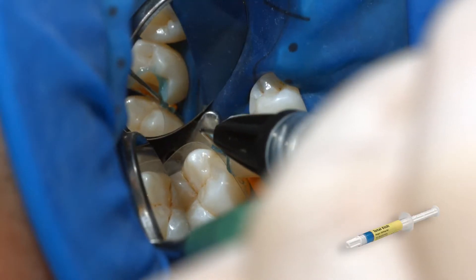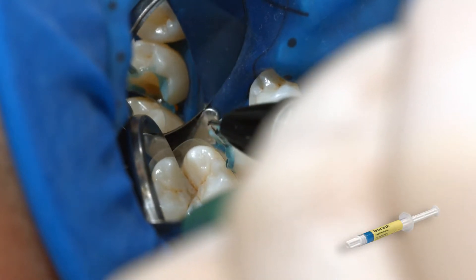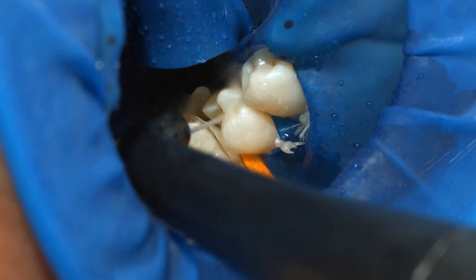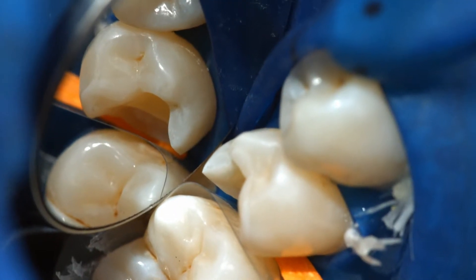Apply Phosphoric Acid Gel, for example Total Etch, to the enamel and allow it to react for 15 to 30 seconds. Thoroughly rinse off the gel with a vigorous stream of water and air-dry the preparation until the enamel surfaces appear chalky white.